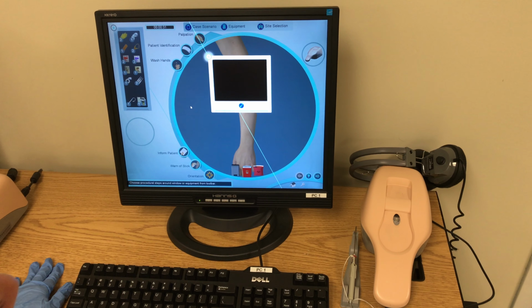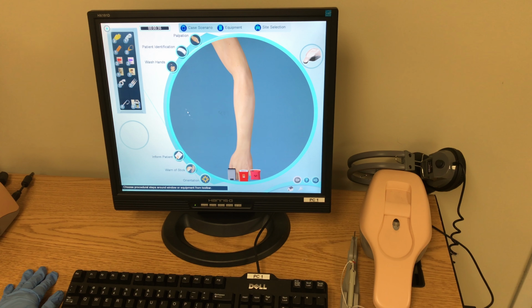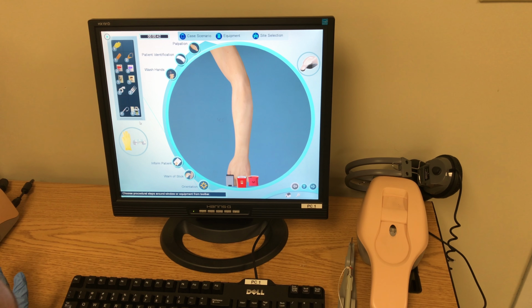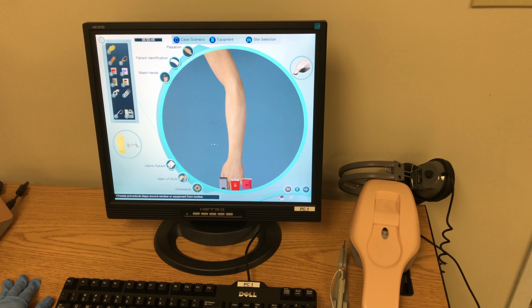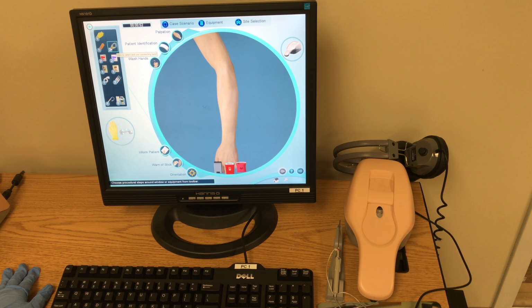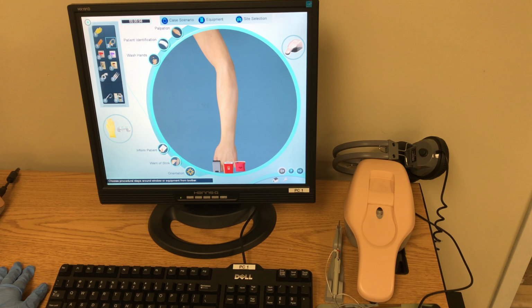This basically takes you step by step through the process. Next thing you want to do is put your PPE on. So you're going to put your gloves and your goggles on. Okay, so now you're prepared to start the process here. The next thing you want to do here in your scenario is you're going to put your tourniquet on your patient. Now remember, the tourniquet, you do not want to have one any longer than 2 minutes. So once you start the process here, you really kind of want to move things along.